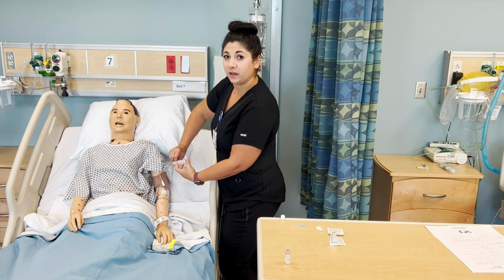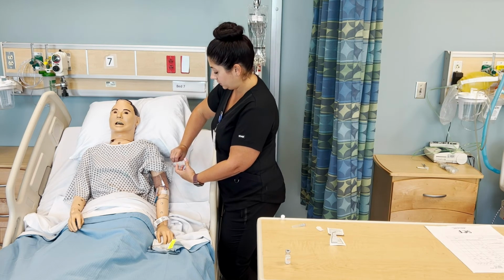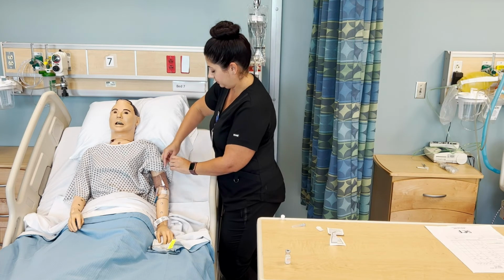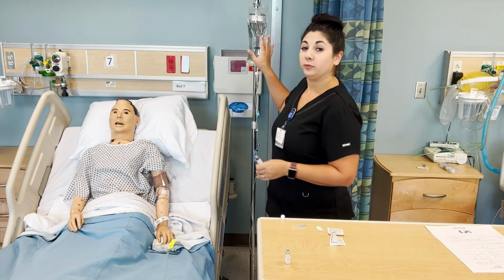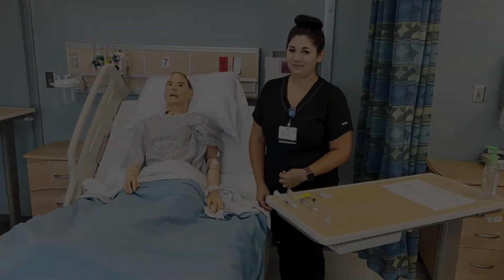And once you do that, you can flush the rest of the 10 milliliters. Then you can unclamp and reset your primary fluids.